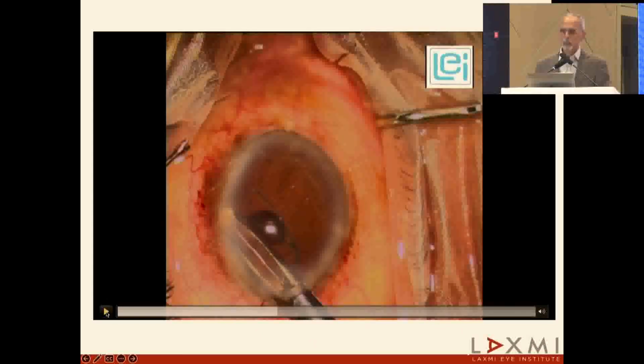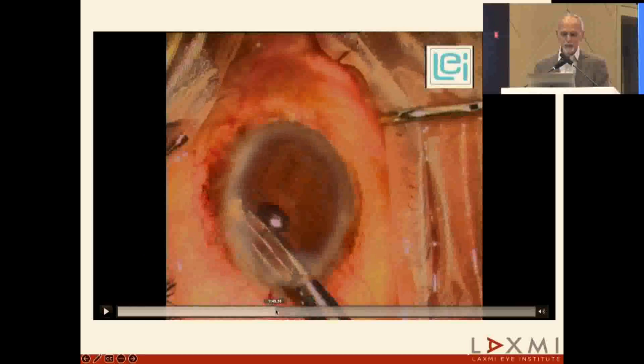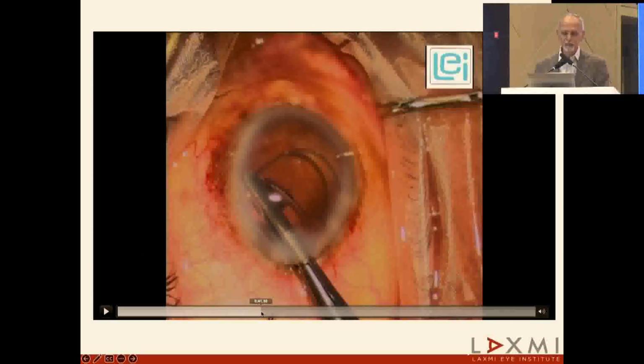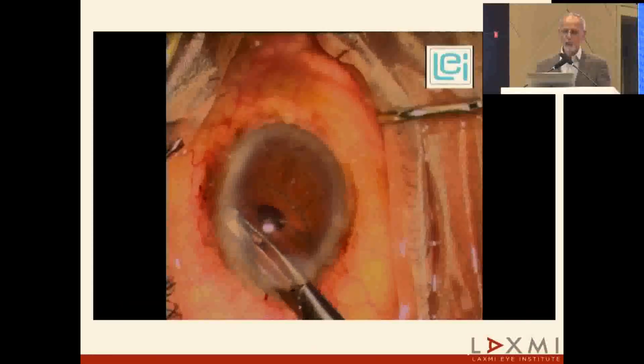In the earlier days when the lenses were implanted, we had the holder and folder method, and the newer surgeons probably have not used it. This folder forceps is used to fold the lens, where the haptics will come like a bucket handle, and go with the haptics pointing forward.